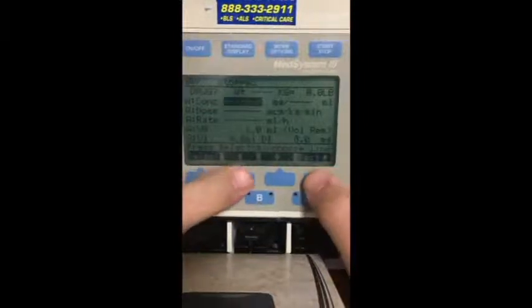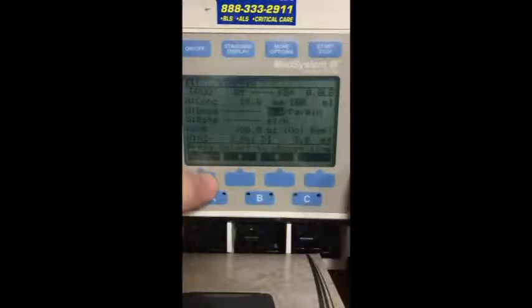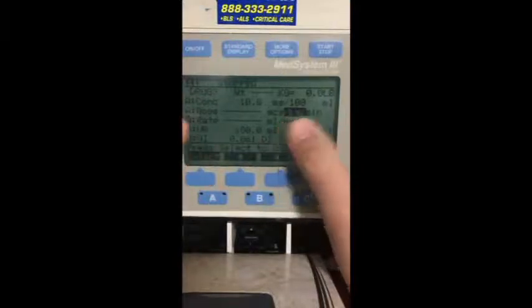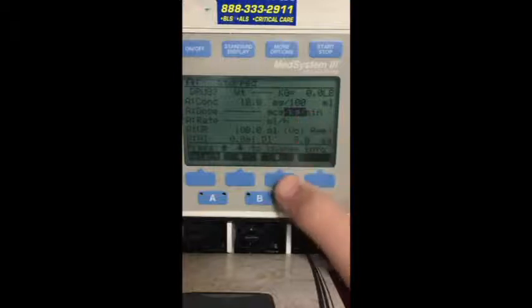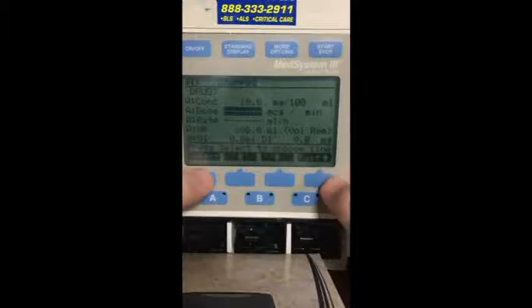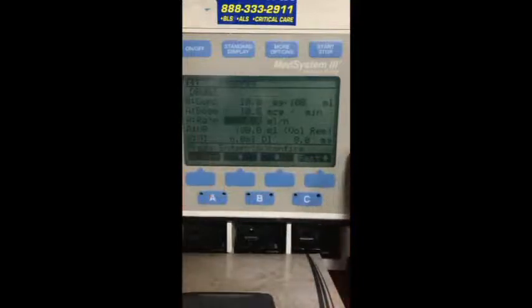The concentration, let's just say you had 10 milligrams and 100 mLs, and you wanted to do not kilograms, you'd select over to the kilograms and then change it. And now you just have mics per minute. And so if we would go up and change it, it automatically selects our rate.